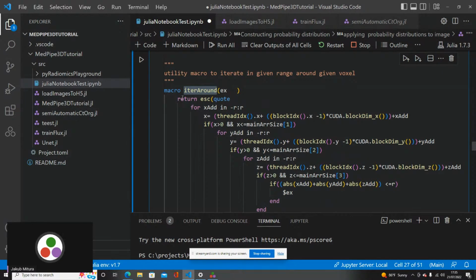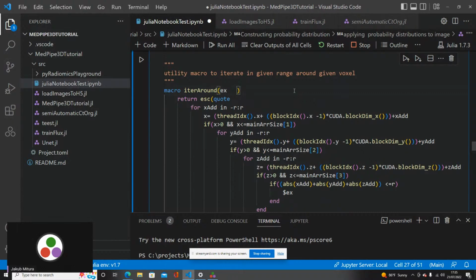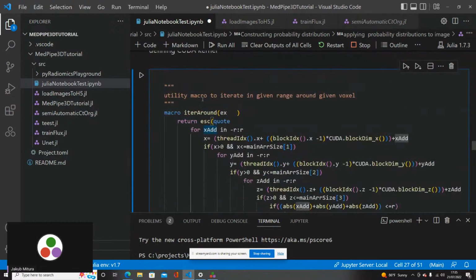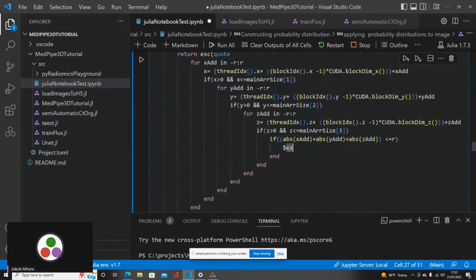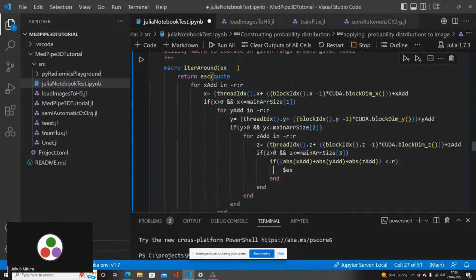What is macro? If you get from some different language, the macro can be a bit foreign, let's say. But macro is just a way of the very smart, very advanced code generation tool. Yes, so when we would execute this macro, the expression would be executed here and would get access to all of the context here. What is happening here? It's relatively simple. So I will draw it in a moment also, but the important idea is that we need to know where we are and establish our position from this point.